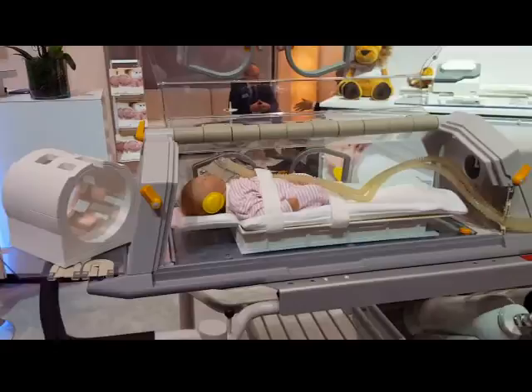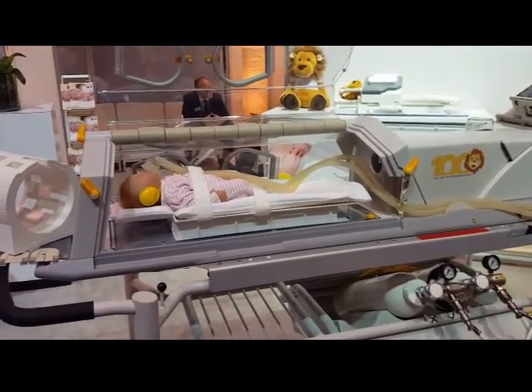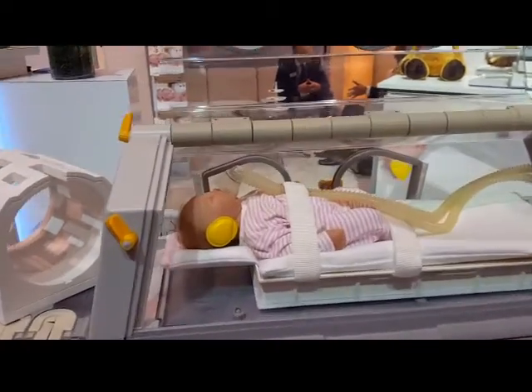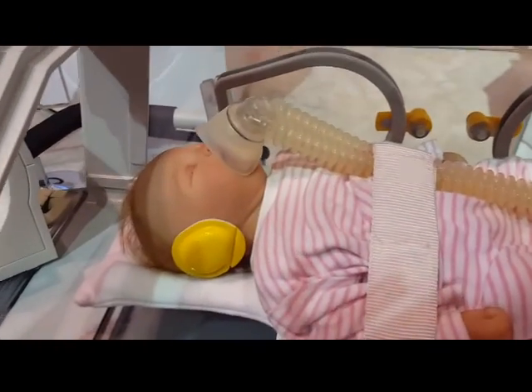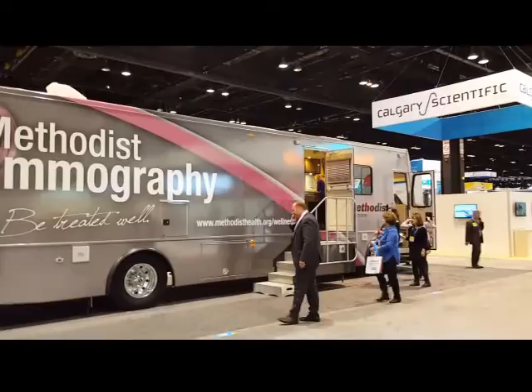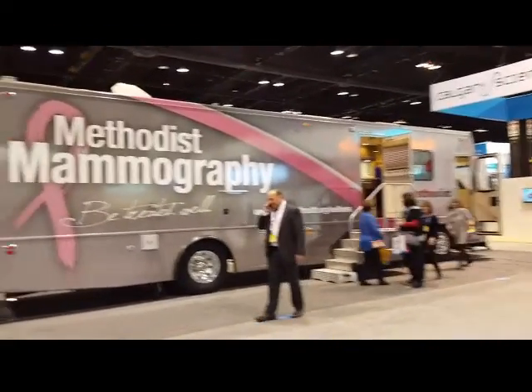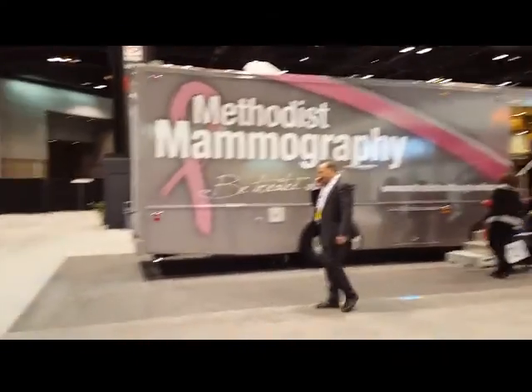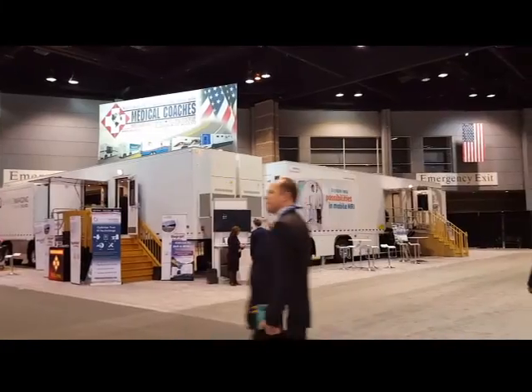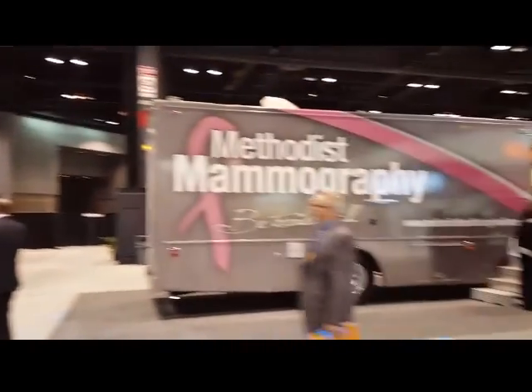Look at this thing. It looks like they even have buses that you can go into and look at for portable mammography and MRI scanners. It's pretty cool.